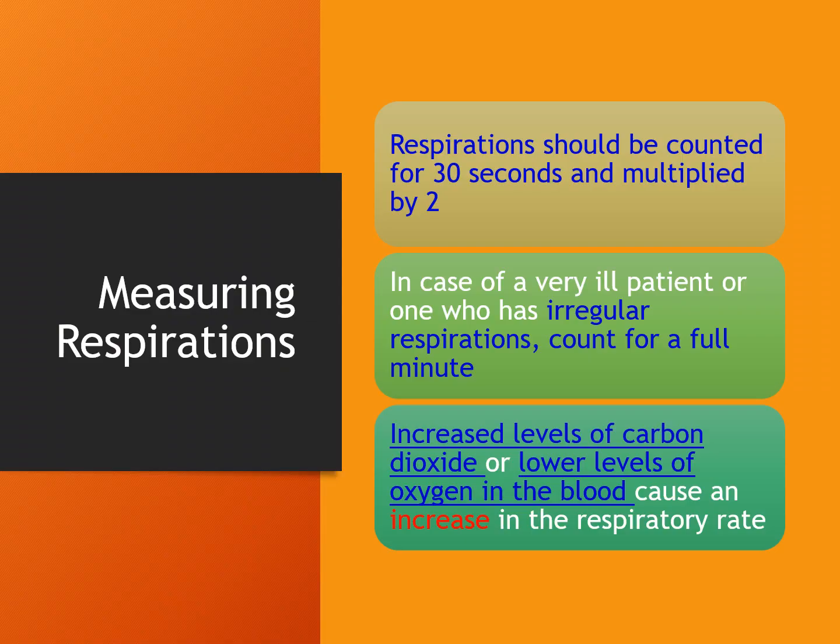Respirations, that's how many times people take a breath in and out. You can count respirations for 30 seconds and then multiply it by 2, unless somebody has really very irregular respirations, and then you need to count it for a full minute.